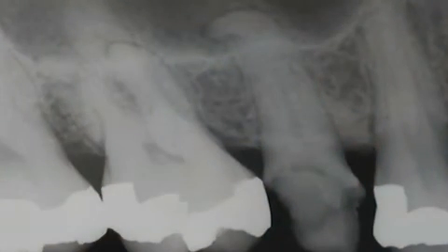From a restorative standpoint, note the recurrent decay and that the clinical crown has been extensively prepared. Endodontically, note the pulp chamber has receded below the crest of bone and that the root is dilacerated in its apical 1/3. Experienced clinicians appreciate that canals are virtually always more curved than the roots that hold them.